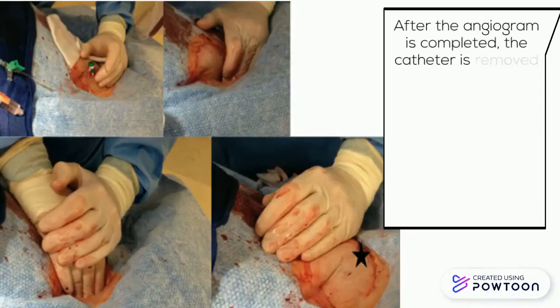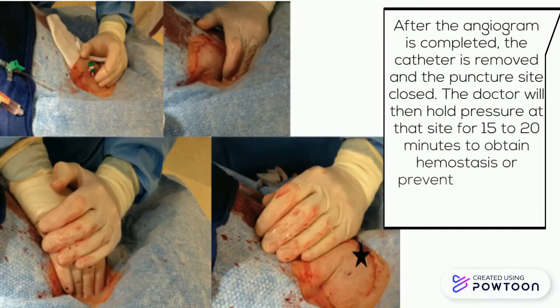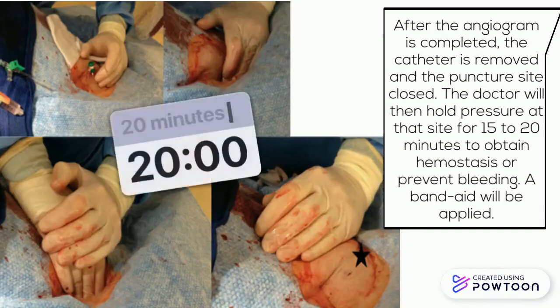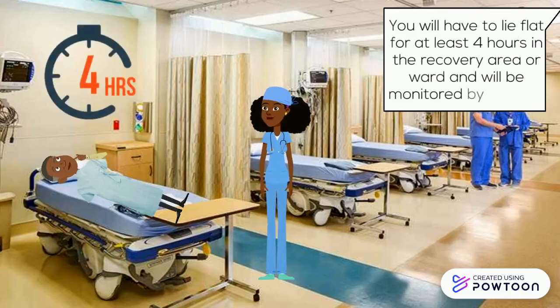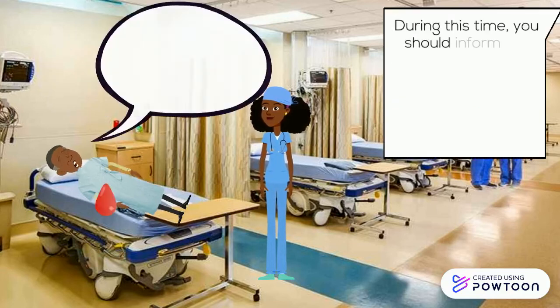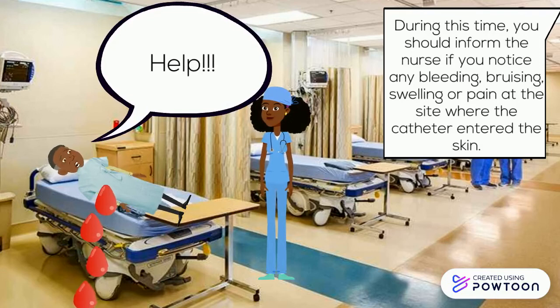After the angiogram is completed, the catheter is removed and the puncture site closed. The doctor will then hold pressure at that site for 15 to 20 minutes to obtain hemostasis or prevent bleeding. A band-aid will be applied. You will have to lie flat for at least 4 hours in the recovery area or ward and will be monitored by a nurse. During this time, you should inform the nurse if you notice any bleeding, bruising, swelling or pain at the site where the catheter entered the skin.